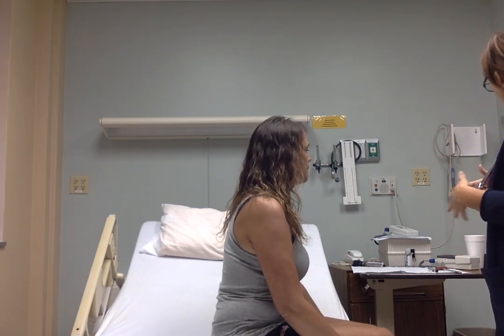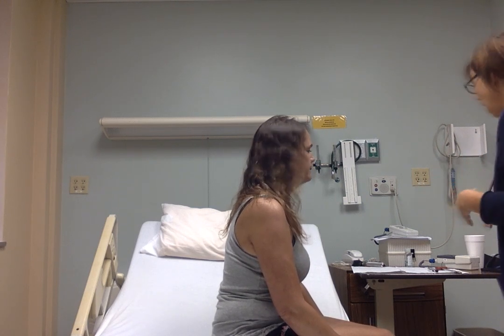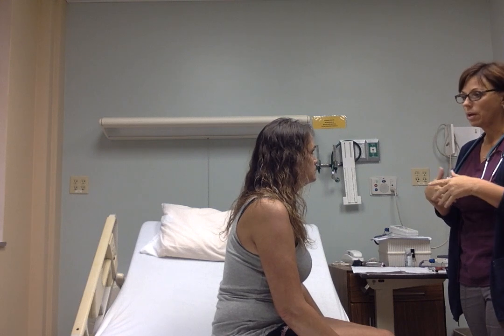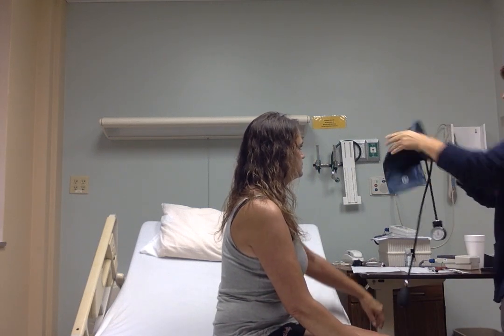We're going to start with vital signs, and if you don't mind, I will be writing as we go along. Are you comfortable in the room? Are you warm enough, cold enough? Yes. All right. Let me know if we have anything that's painful or you're uncomfortable with. All right? We're going to start with your vital signs and your blood pressure.